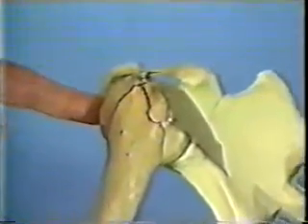Our example shows a type B, or three-part fracture, with considerable displacement of the greater tuberosity by pull of the rotator cuff. Closed reduction and maintenance appears rather difficult.